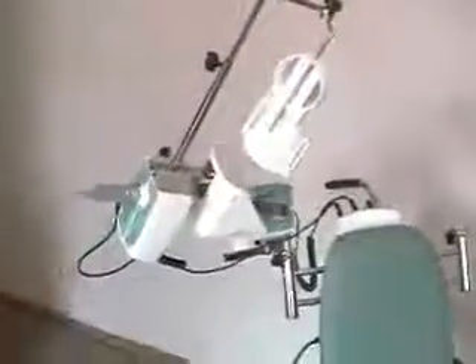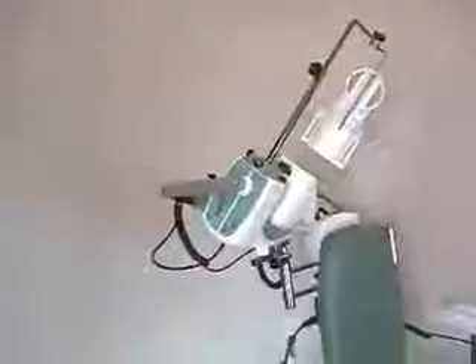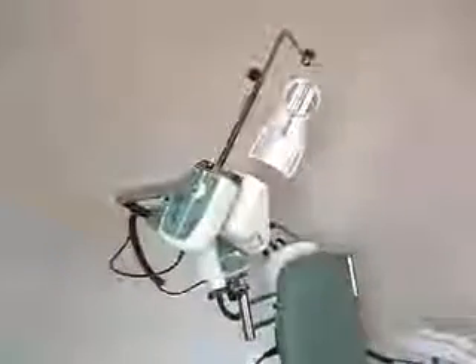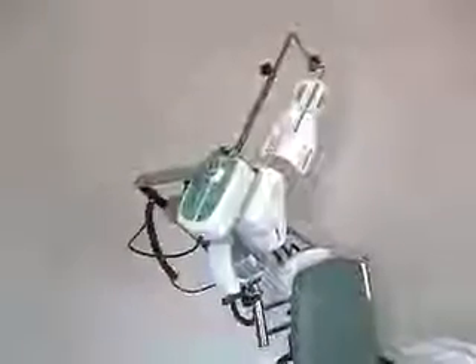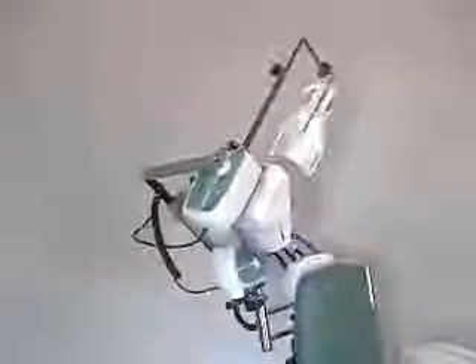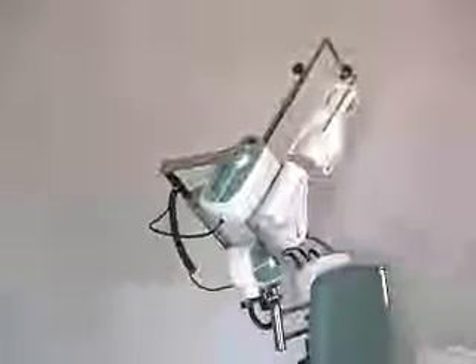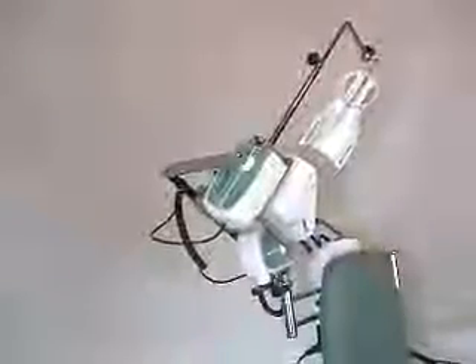You'll see that it is a truly synchronized motion. So we are moving synchronized into abduction with external rotation, and then on the way back down we will be going towards internal rotation with adduction.